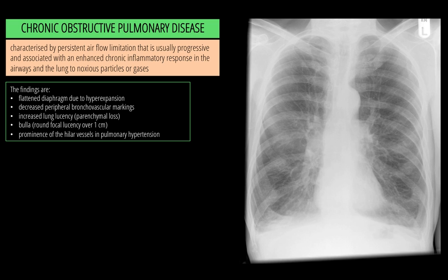So I hope that this video has provided you with a clearer indication of how to recognize abnormal chest radiographs and provided you with the competencies to be able to recognize abnormalities in the form of consolidation and lung collapse by tracing the cardiomediastinal contours as well as the hemidiaphragms, and also become familiar with the assessment of pneumothorax, looking for key areas of the introduction of air or gas, and then lastly finishing off with COPD and emphysema.